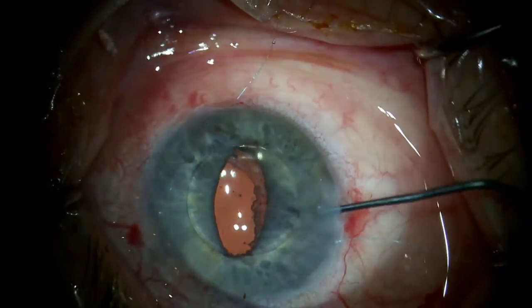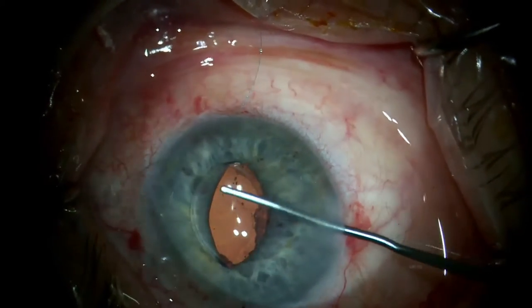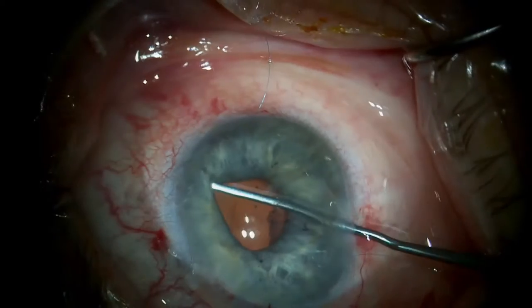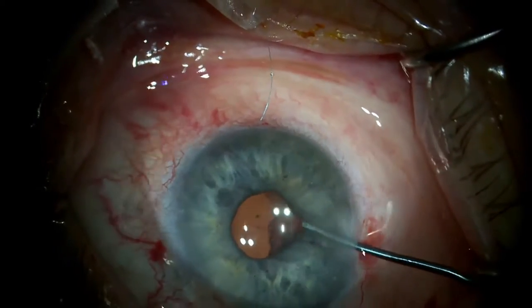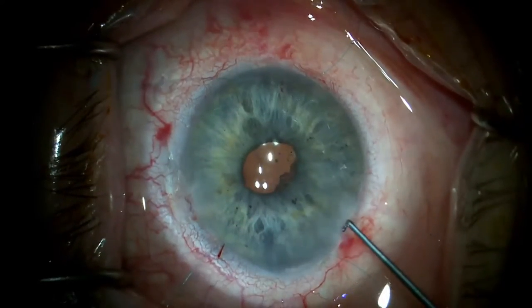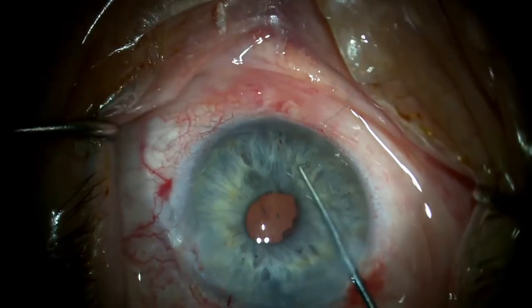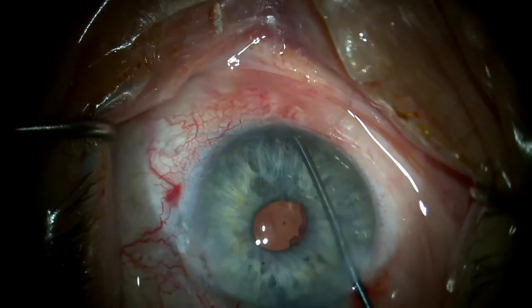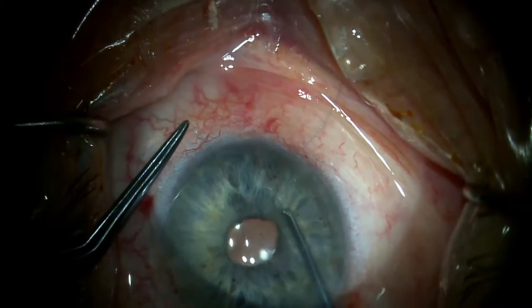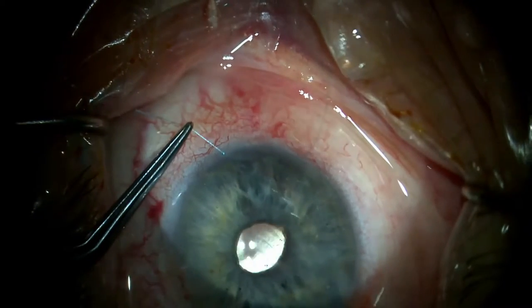The IOL manipulator is used to push the optic behind the iris while the iris fixation sutures are under the haptics but not yet tied. The iris is retracted to inspect the IOL and ensure good centration of the optic. The straight IOL manipulator is then used to hook one side of the suture between the iris and the cornea, then retract it through a convenient paracentesis opening.